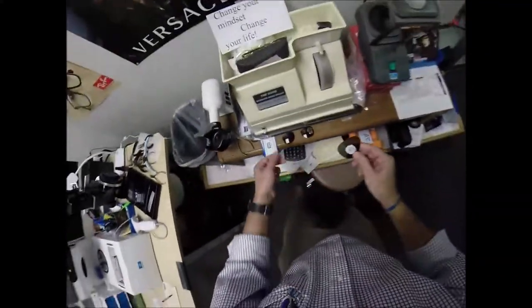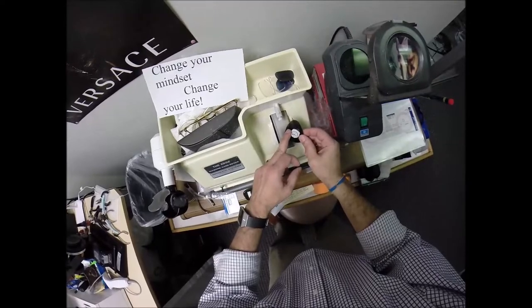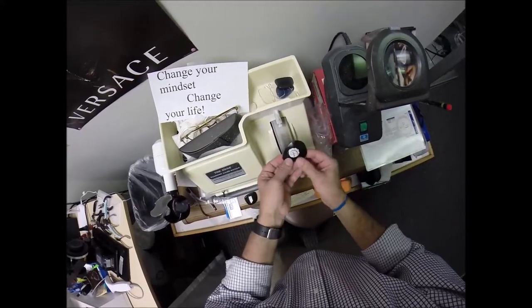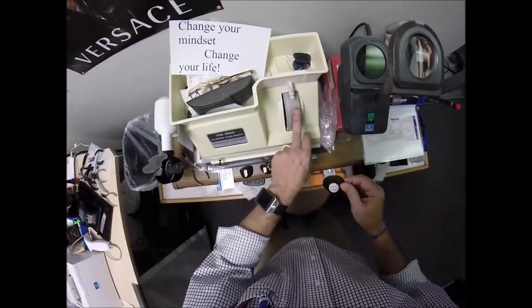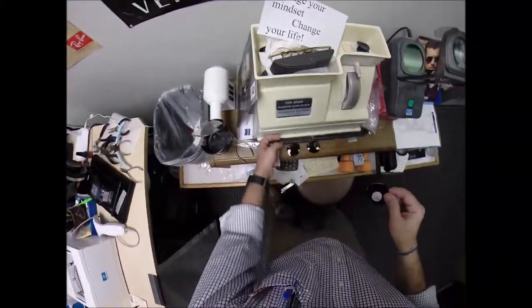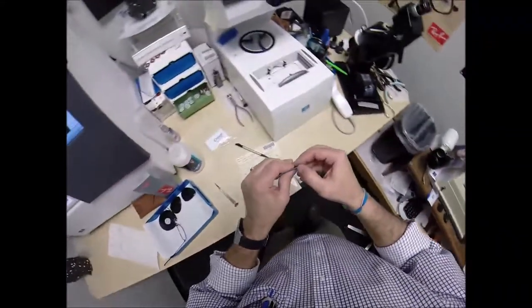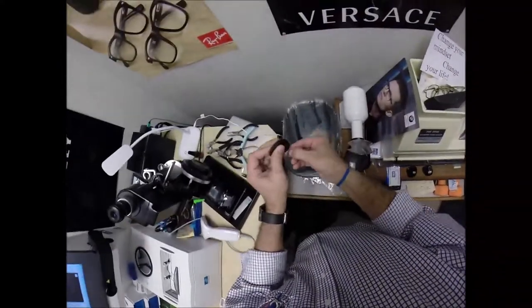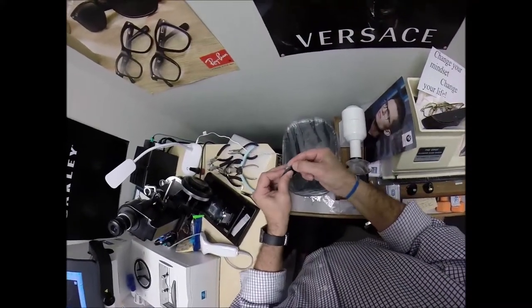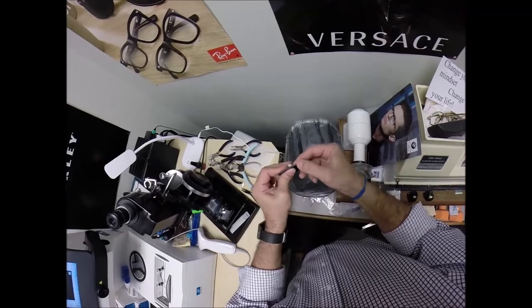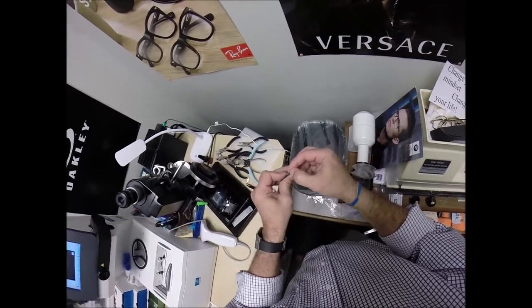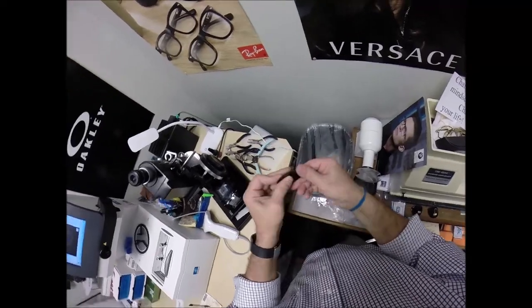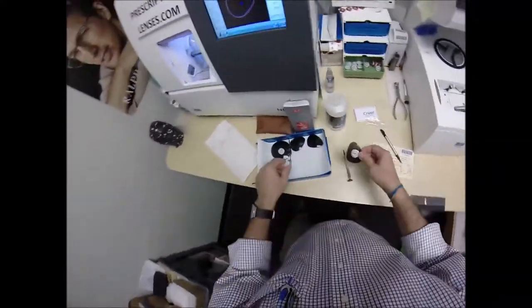Just like a small load of laundry. And literally, it's the friction that is melting the edge. I can put my finger against this and it gets very hot. Friction. The friction. Which Dave understands all too well. Friction. He does some really cool things. And he has designed all his engineering to work around the never-ending force of friction.